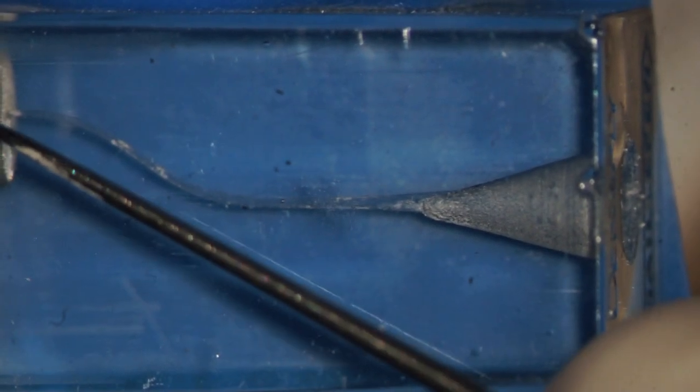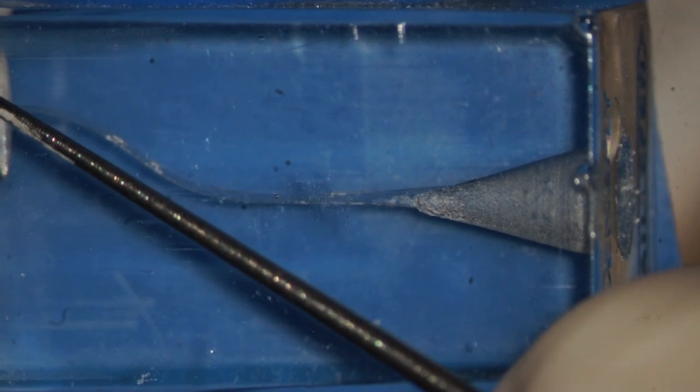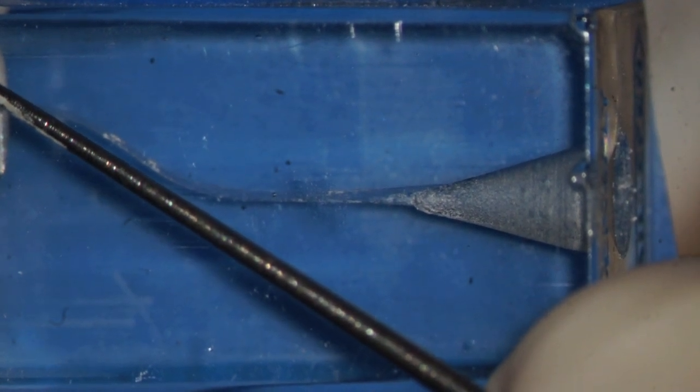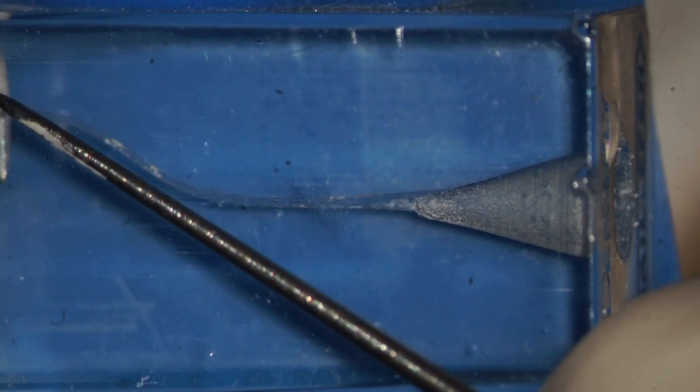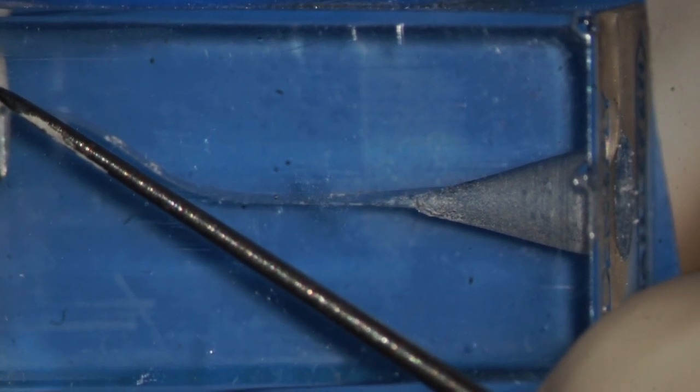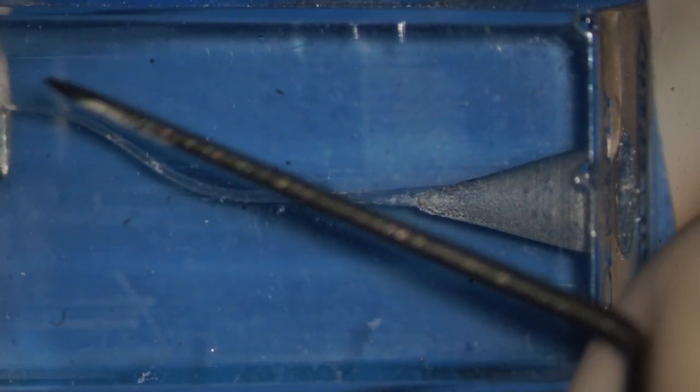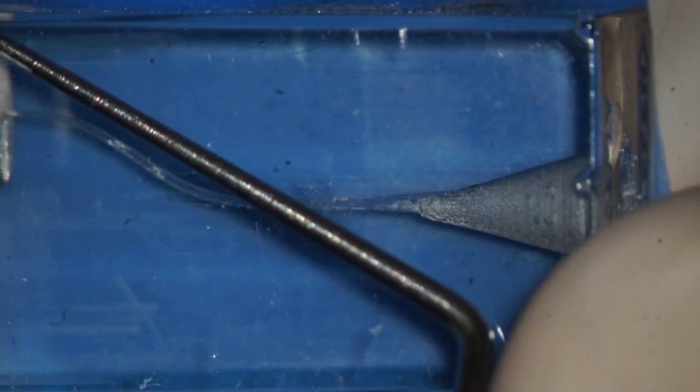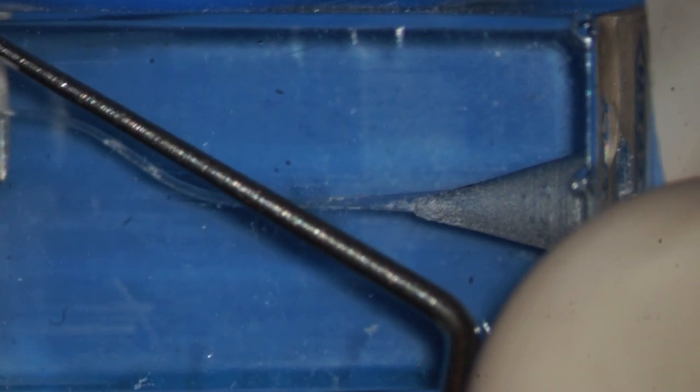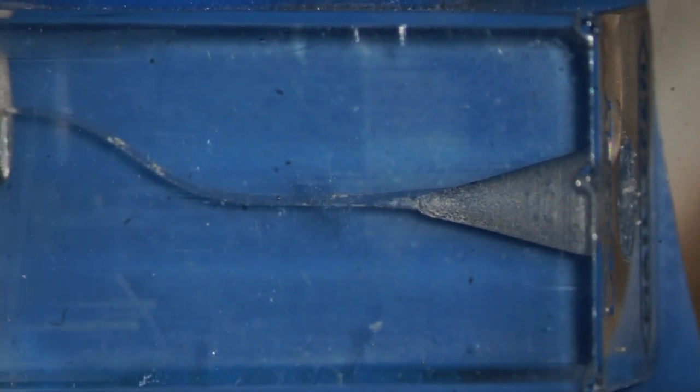You can see a little bit deeper, here the canal has its first curve, and if I hold the explorer to the first curve relative to the straight away portion, you can judge that angle to be about 40, 45 degrees. Then the canal makes a second curve, and if we put the explorer tangential to the apical third relative to the first curve, you can see that's probably about 30 degrees. The canal ends right inside this little well, and that would be the terminus.